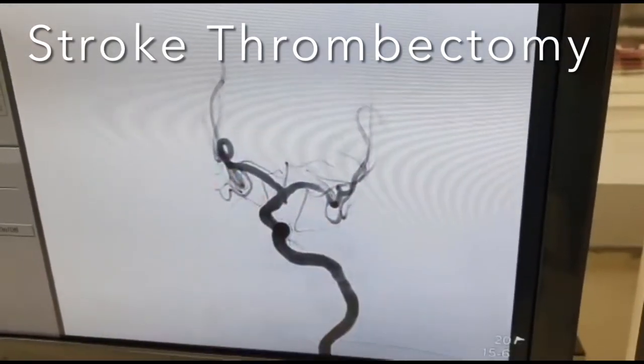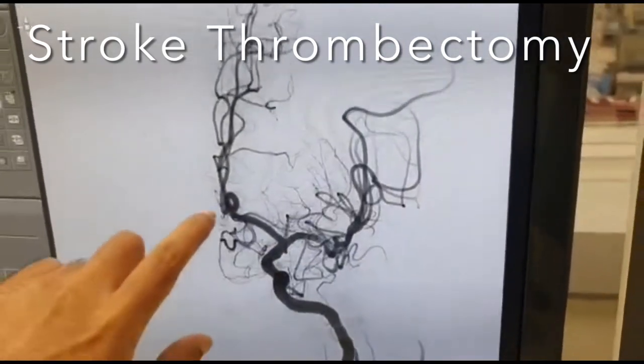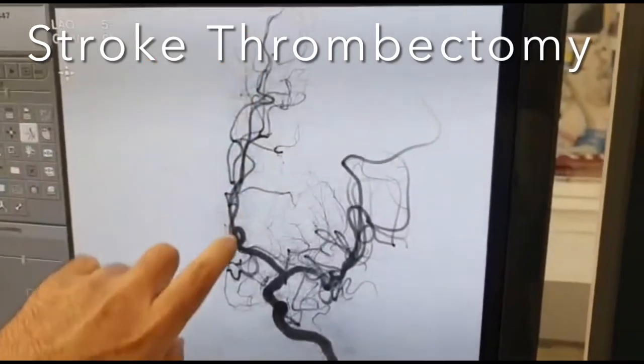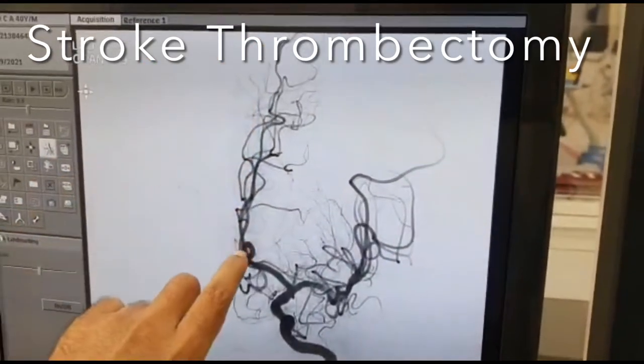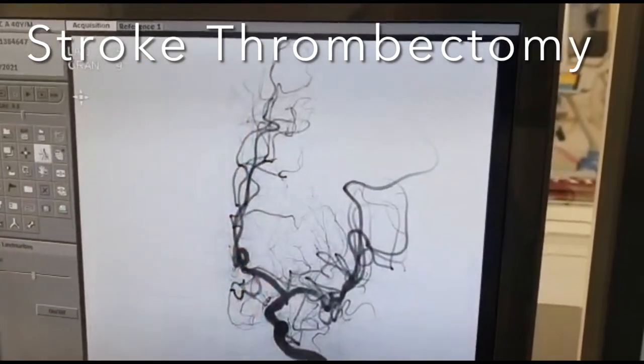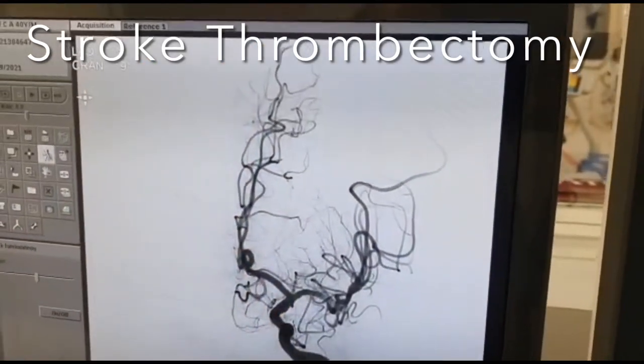There is no embolism to other territories. ACA is normal. A1 is normal. The vessel is also normal.